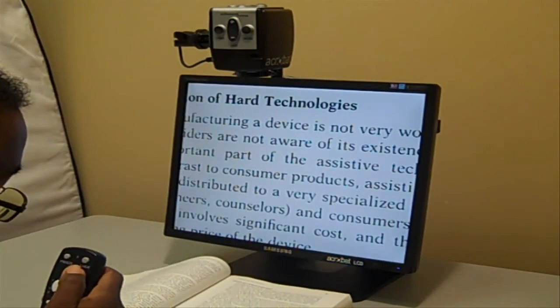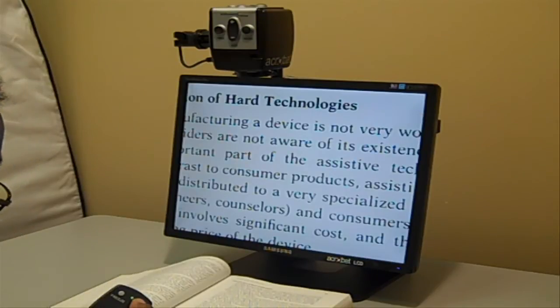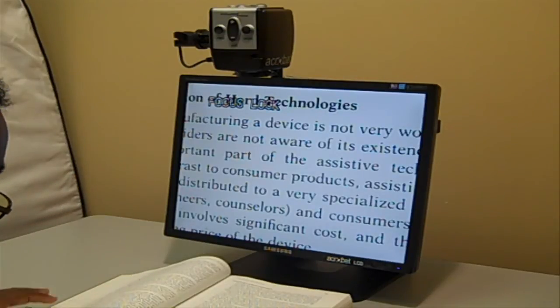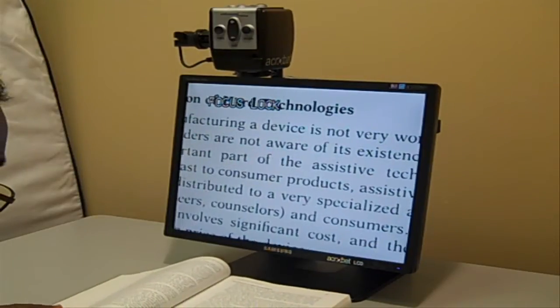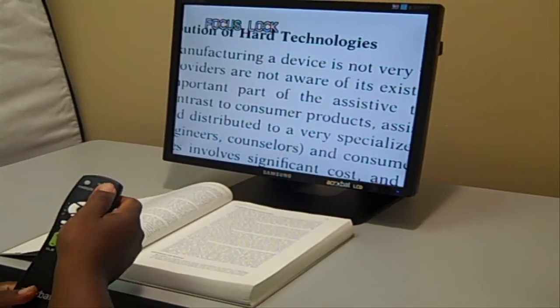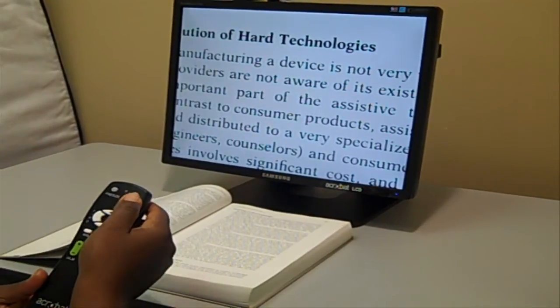On the remote you also have a freeze button and a lock button. The lock button locks the focus in so you don't have to worry about trying to adjust it. You can move it off screen — it detects the off-screen position — and pull it right back, and it's still on the same magnification. All you have to do is re-press the lock button to unlock it when it detects off, and then you can adjust your magnification.